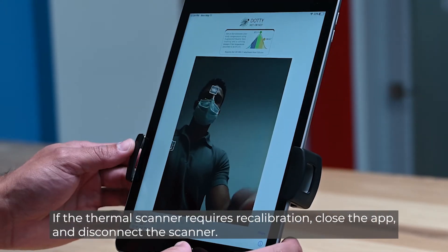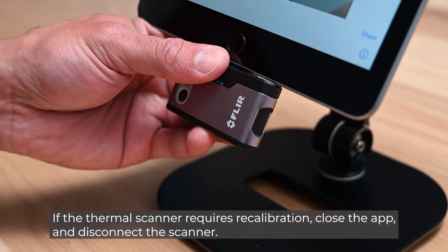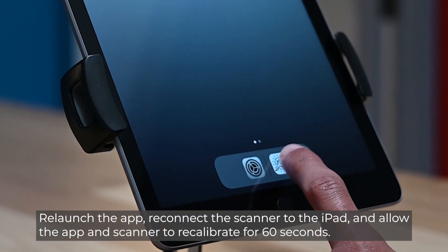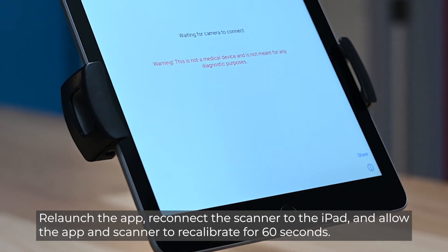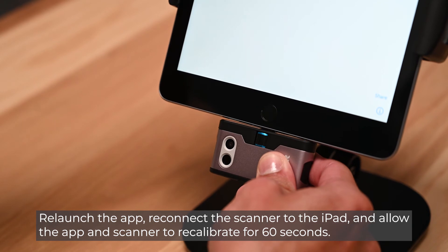If the thermal scanner requires recalibration, close the app and disconnect the scanner. Re-launch the app, reconnect the scanner to the iPad, and allow the app and scanner to recalibrate for 60 seconds.